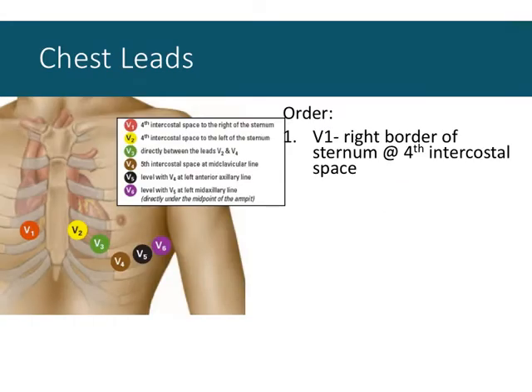Okay, so to compare to these leads, we add some physical electrodes across the chest and towards the side under the axilla, the armpit, to generate our horizontal plane. View the heart horizontally at a perpendicular plane to the frontal plane we just described. All of these leads are called V leads. They're a prefix V to indicate they're chest leads. I'm not sure what the V exactly stands for. And they're all single electrode leads.